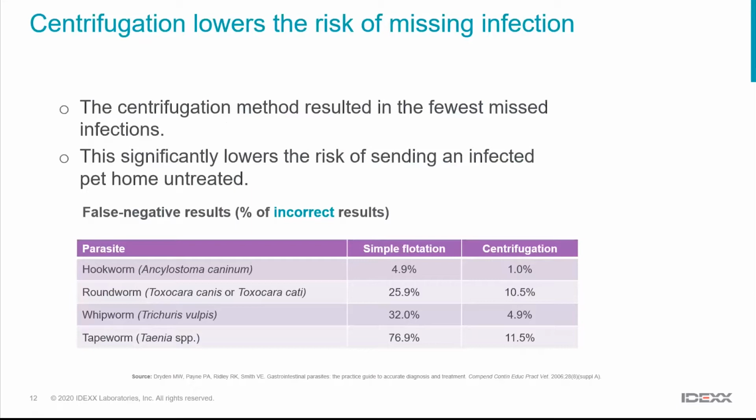No one likes doing the fecal floats in clinic. They're smelly, they're messy, they can mess with your microscope. So we can send it to the laboratory to get a technique done by trained scientists, and also a technique that has higher sensitivity. So we're going to pick up more infections with that. So there's really nothing to lose by doing that.